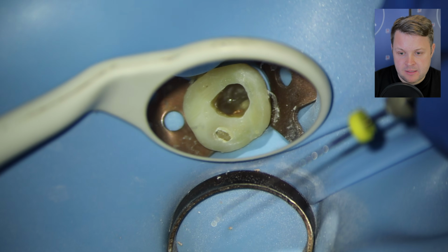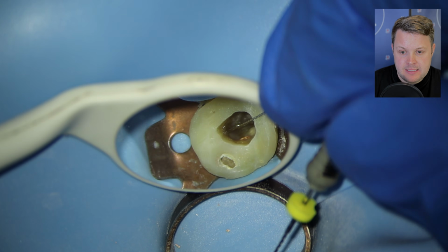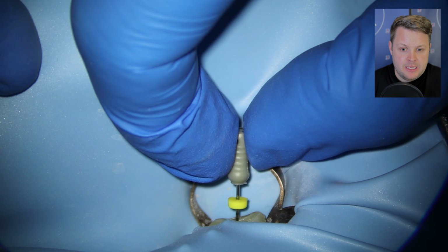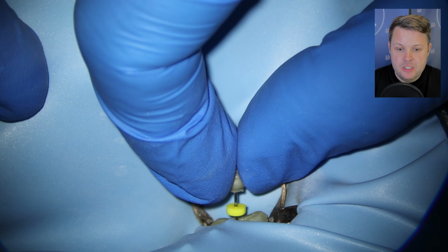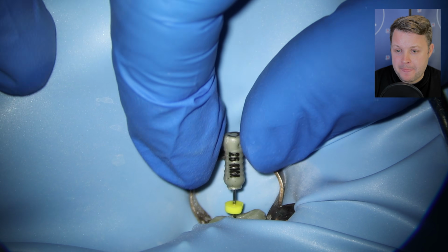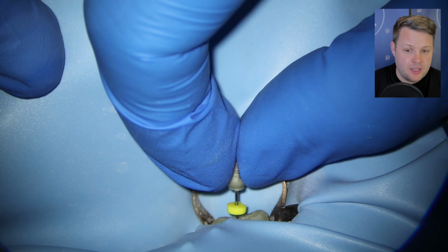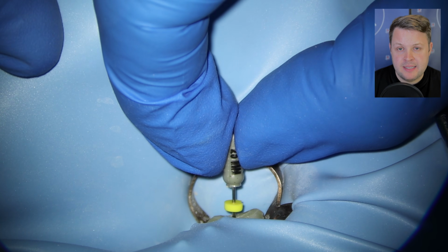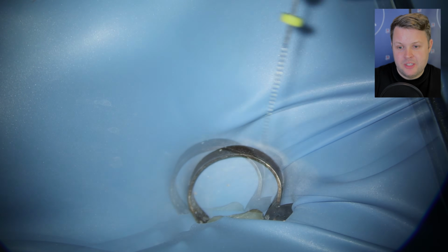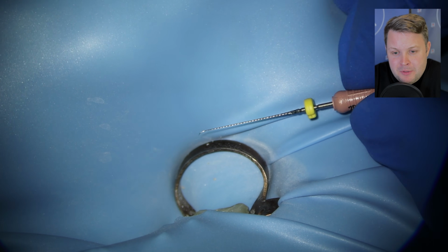So these C+ files are stiffer, and they keep their shape more. And then what we're doing is making a little bend at the end. I'm just going to feel around for this catch. And the amount of times that I've found the catch is more often than not. But again, in this case, I just cannot for the life of me reach past this furthest point, this 19.5. And then our last ditch attempt is to use a size 6 C+ file.